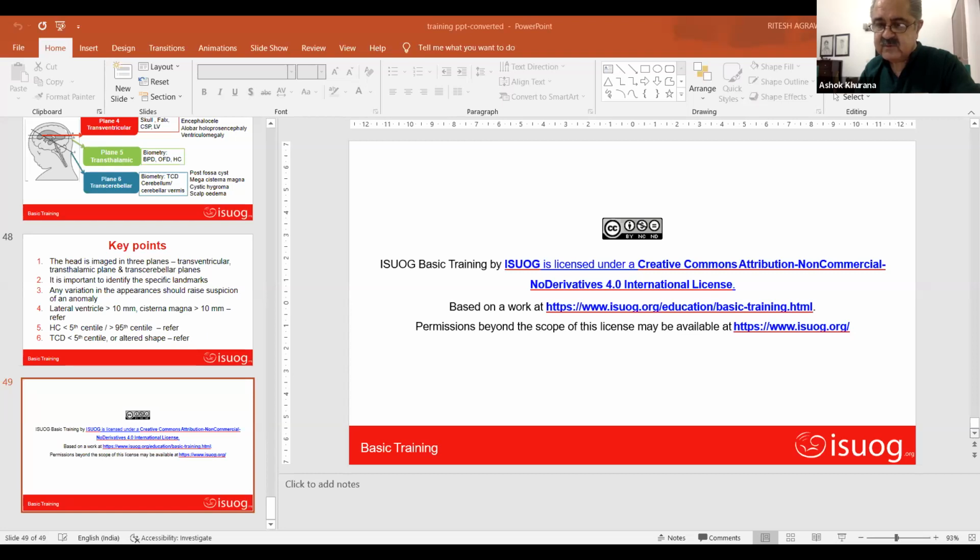And if there is a huge big cystic mass, with an upward rotation of the tentorium and the cerebellum, that becomes Dandy Walker. So these definitions are well known, but they are to be applied at the right time of pregnancy, and the prognosis is different. And if you follow what you've just heard, there is no way that you're going to miss these. So please treasure this as an excellent talk that we have heard, and go step by step and make sure that we make the right diagnosis.